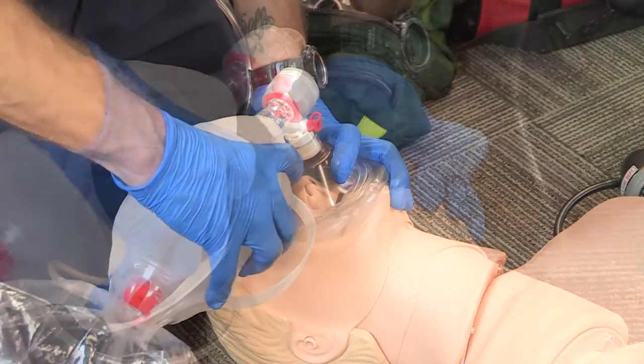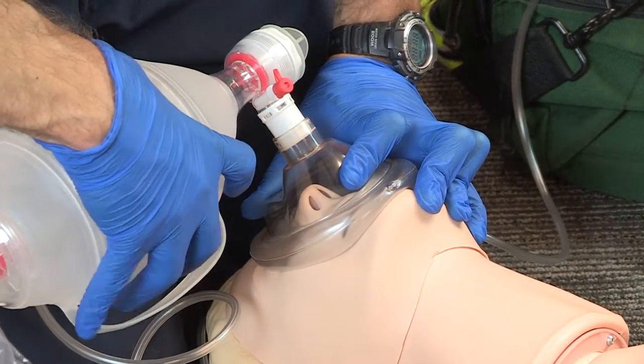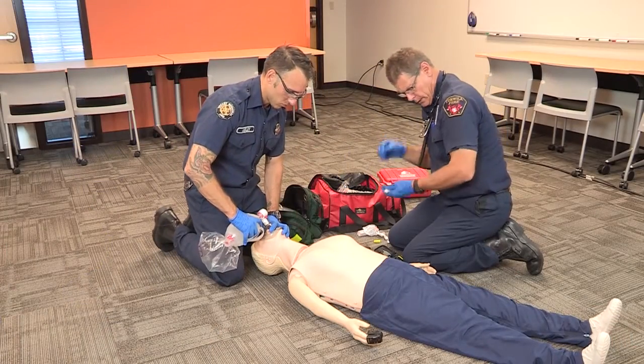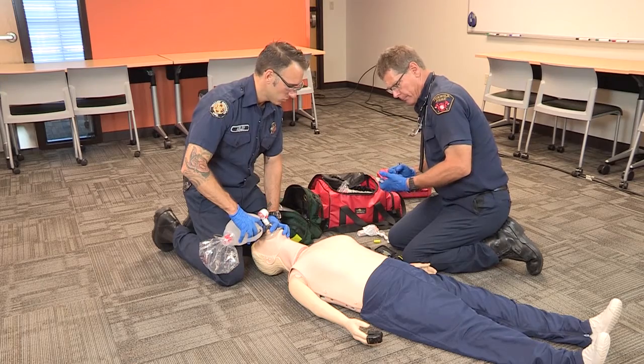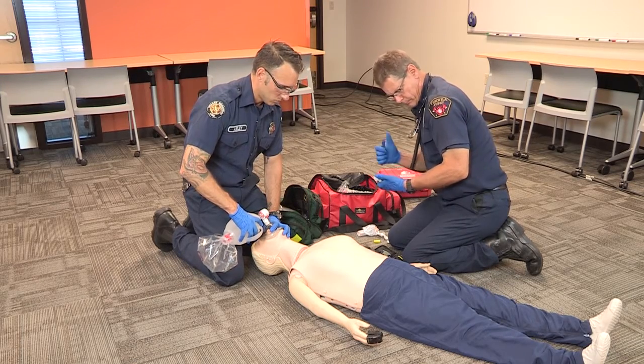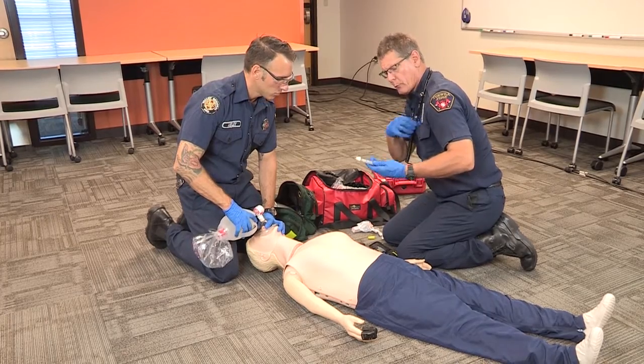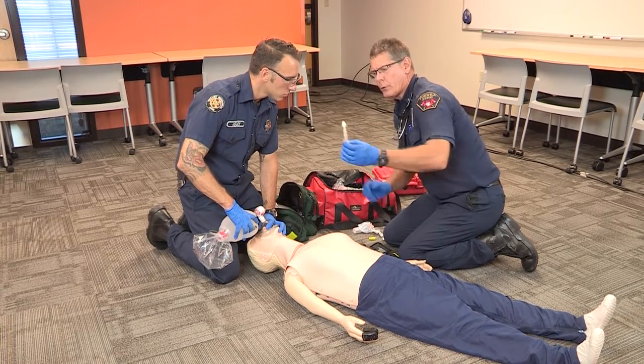Administer one milligram, which is only half the vial, into one nostril. Once the Narcan has been administered, immediately resume ventilations with the bag valve mask and annotate the time the Narcan was given. Time is 11 o'clock — I'll make that notation right now. Re-verify that I did indeed give one milliliter; we now have one milliliter left over.